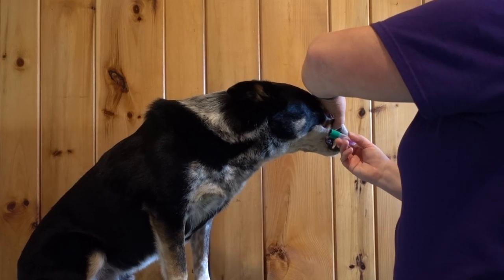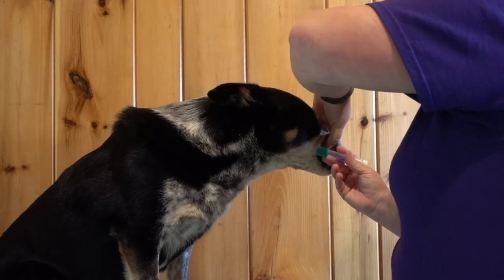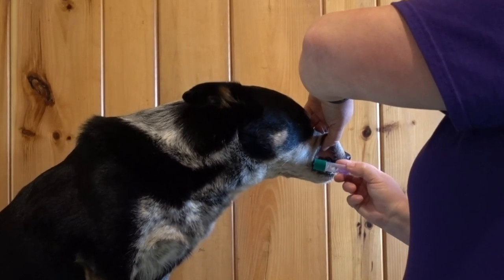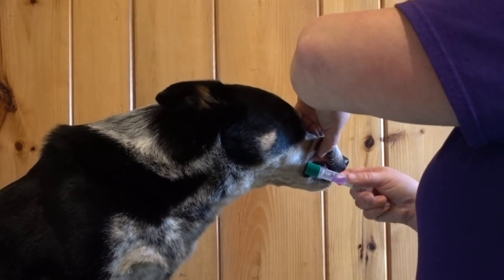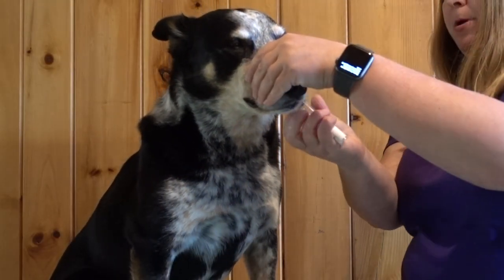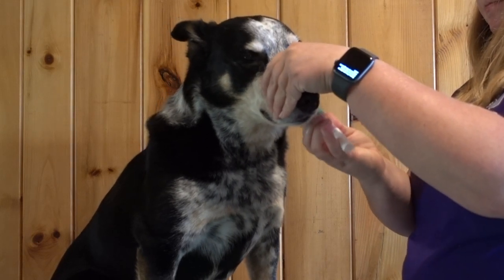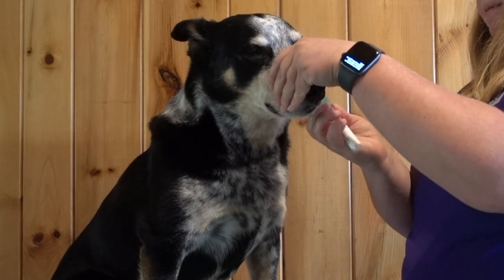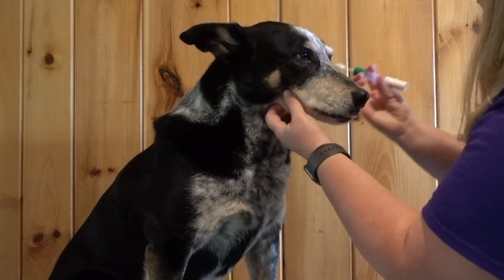Your goal when you do this cheek swab is to swab the lower cheek pouches for a minimum of 30 to 60 seconds, with the goal being that the sponge be fully soaked. It's really helpful if your dog has some semblance of cooperative care behaviors like a chin rest, or if your dog is used to having its teeth brushed. If your dog doesn't like its mouth being handled, it may be time to practice those things in a positive way before subjecting them to 30 to 60 seconds of swabbing.